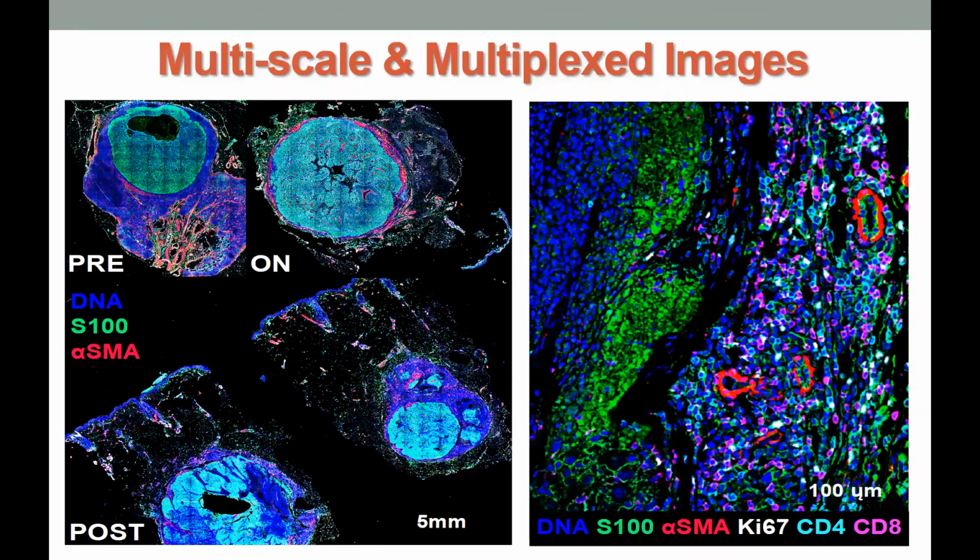Okay, as you can see here, the whole procedure is quite straightforward and simple. I think that's another advantage of using CySIF: nothing is proprietary. Although we do use an automatic imager and tissue processor to increase our throughput, if you want to use a more semi-automatic or manual way to do that, that's totally possible.